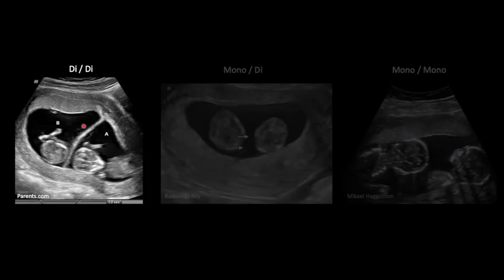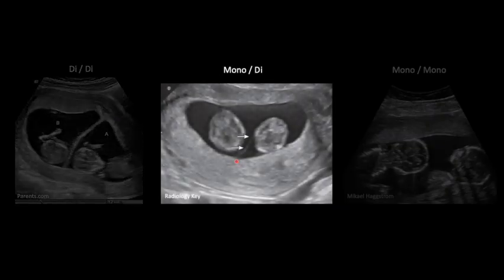This is an example of di-di twins, and here we see the membrane. A couple of takeaways: this intertwin membrane is much more thickened than we'll see in our mono-di twins. And we see that the placental interface has this peaked appearance. It seems to come up into a mountain as we traverse this membrane between the twins. We can compare that to a mono-di twin, which has a much thinner membrane because it's only one layer, and it's not peaking where it's interfacing with the placental wall or with the chorion at all.